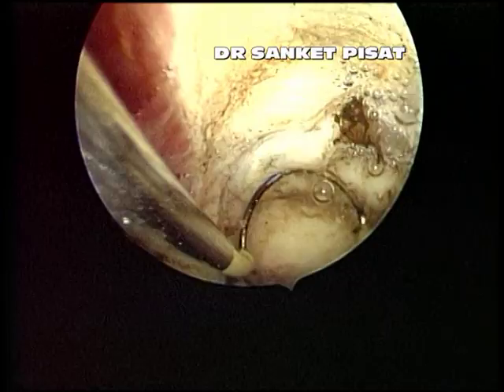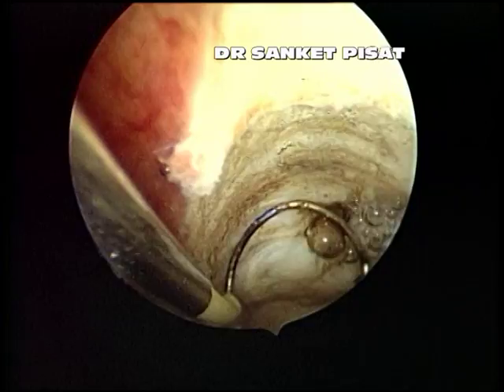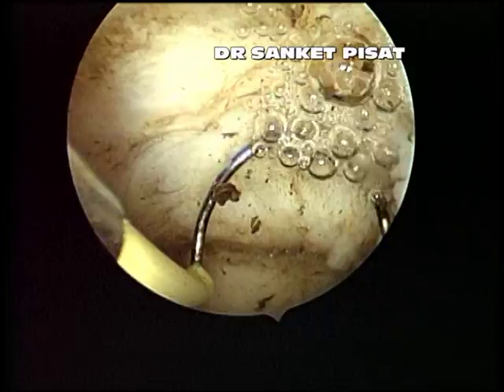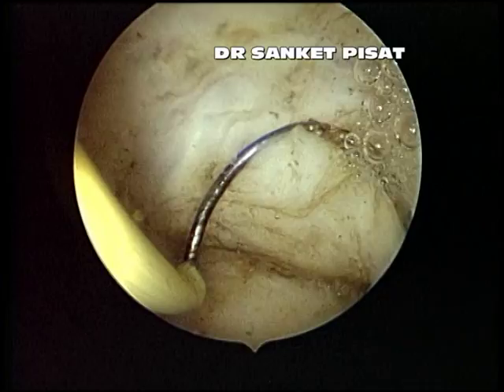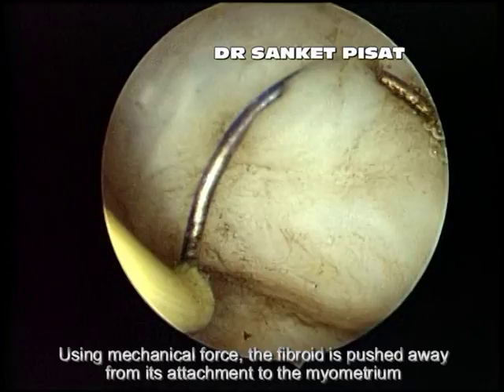Following the same principle as discussed earlier, rather than dissecting into the myometrium using a burrowing technique and increasing the risk of perforation, the extent of the fibroid is first carefully determined by the operating surgeon. Next, using a cold loop dissection technique, an attempt is made to push the fibroid away from its attachment to the normal myometrium. This displacement is sometimes towards the surgeon and sometimes away from the surgeon, in a gradual effort to shift the fibroid away from its original position. Using mechanical force, the fibroid is pushed away with the resectoscope loop and gradually the fibroid is seen to be shifting closer to the endometrial cavity.